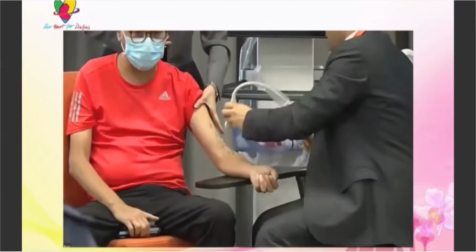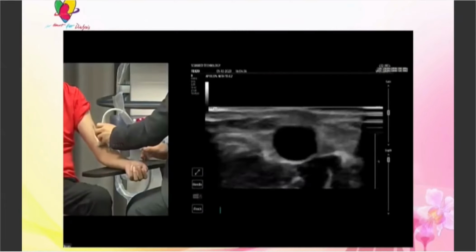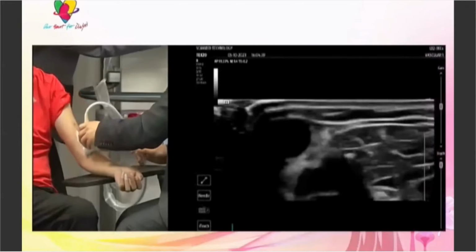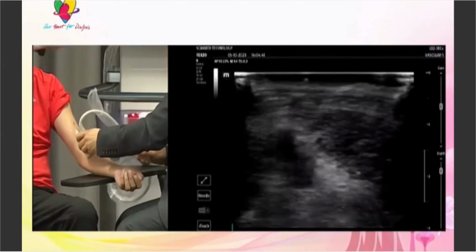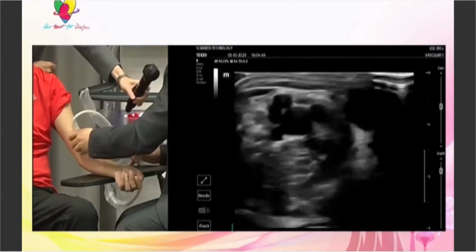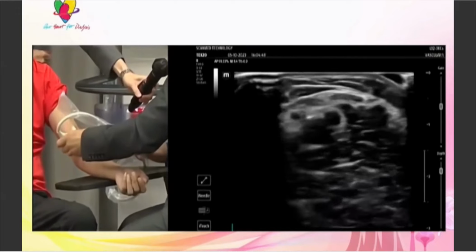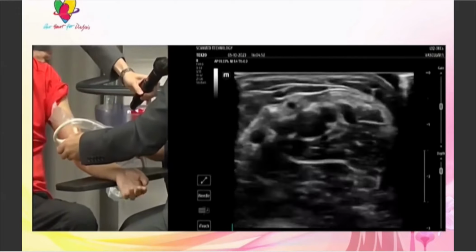So require compression or no need? By now, I think no. Okay, so you see the ultrasound, and I don't know this fistula, so I don't know what the outflows are. The first thing when I would see an endo AVF, I would look into the brachial artery and brachial veins.